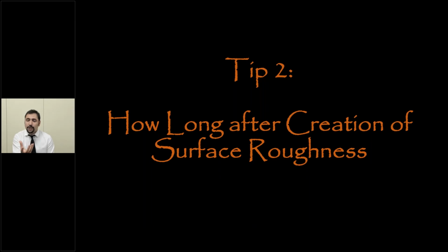of the crown. Increasing surface energy means that the surface is going to be hungry to absorb MDP, or phosphate of the saliva, or anything around it, the dust. The surface energy is so high that it can absorb much more from the environment than before. So here's a question.